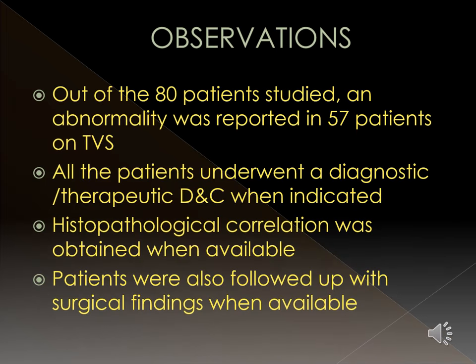Observations: out of 80 patients studied, an abnormality was reported in 57 patients on TVS. All the patients underwent a diagnostic and therapeutic DNC when indicated. Histopathological correlation was obtained when available. Patients were also followed with the surgical finding when available.